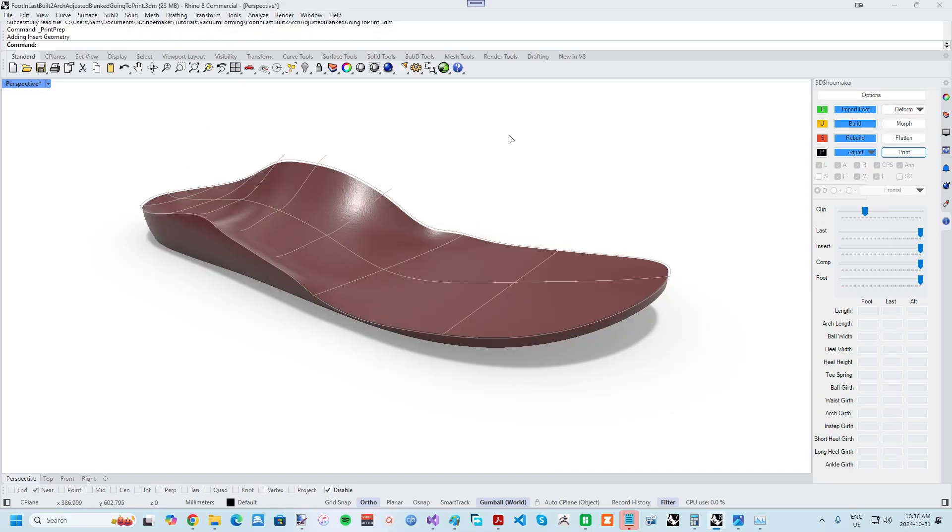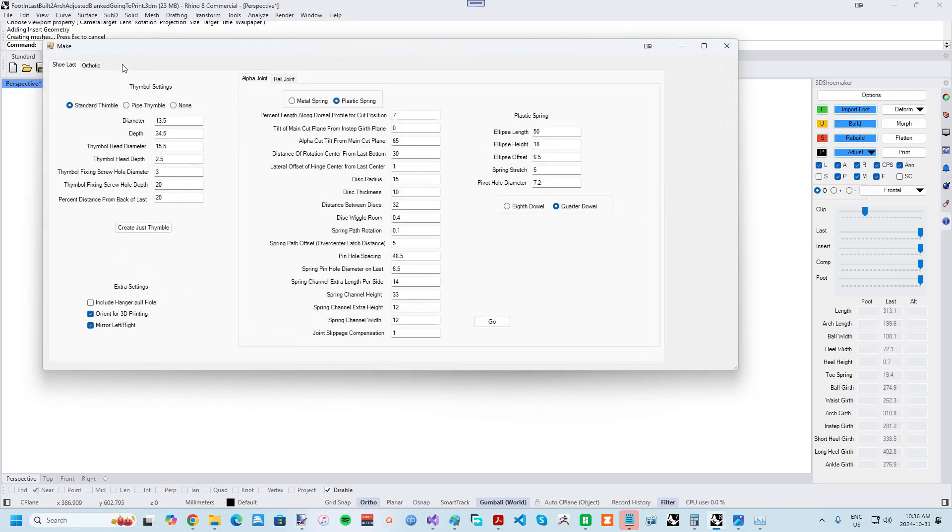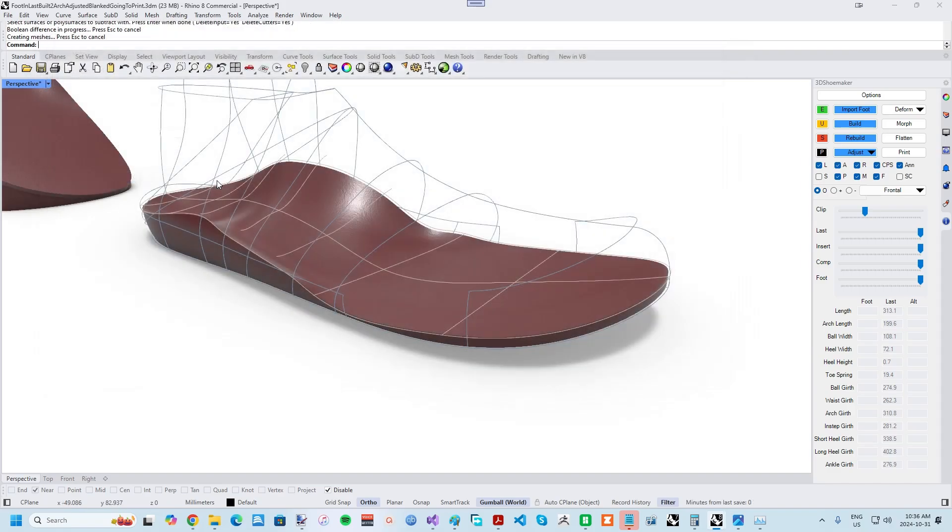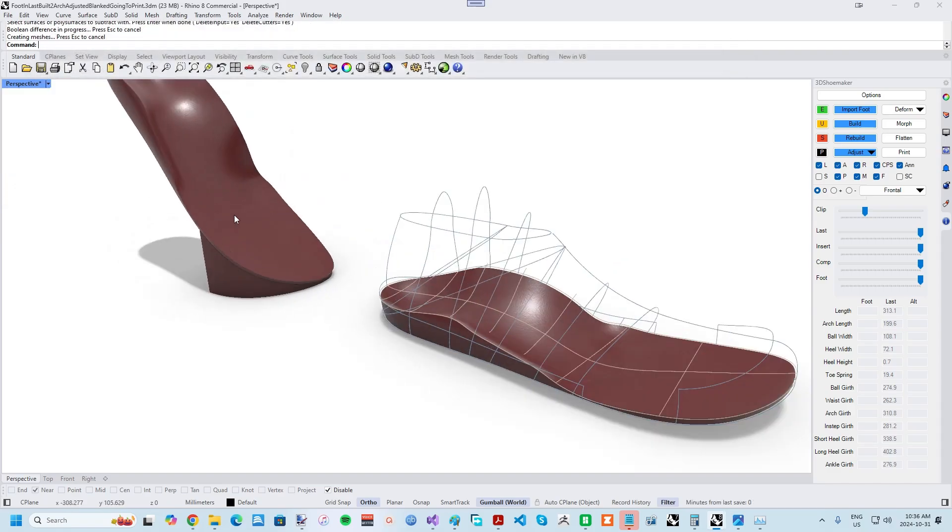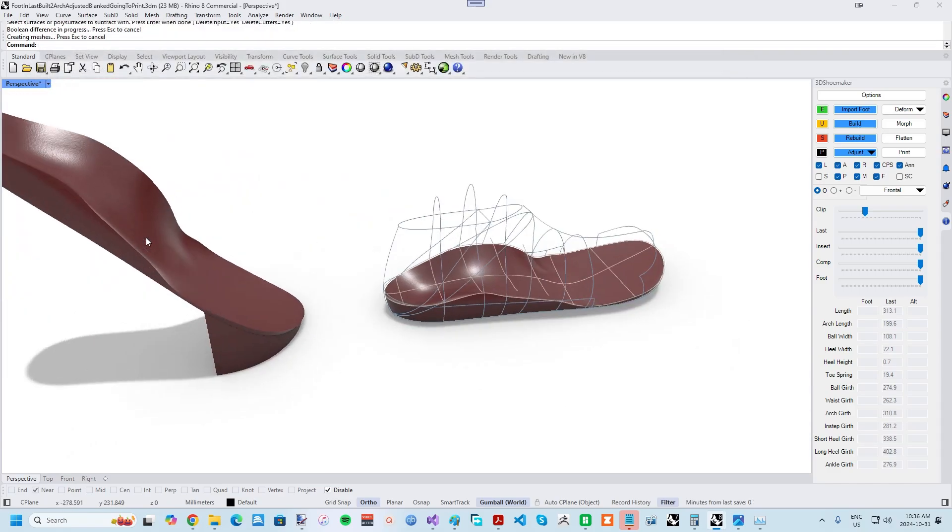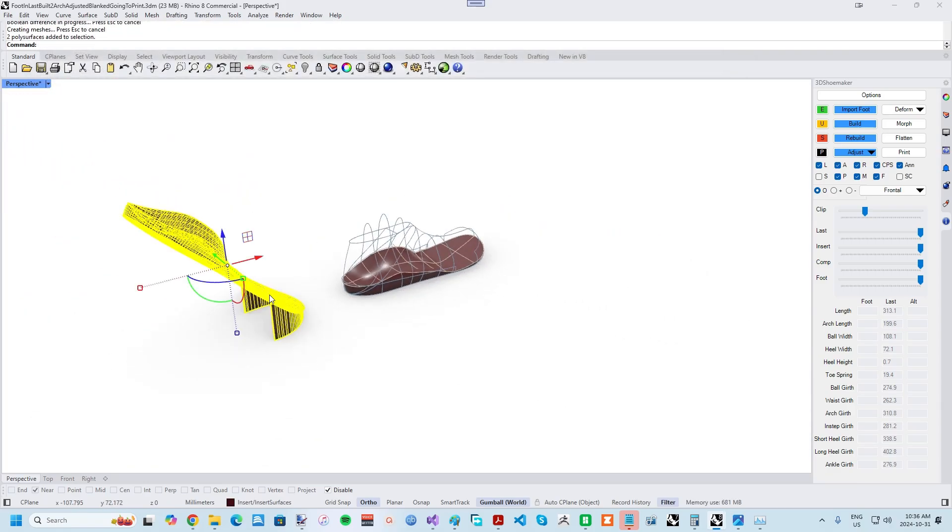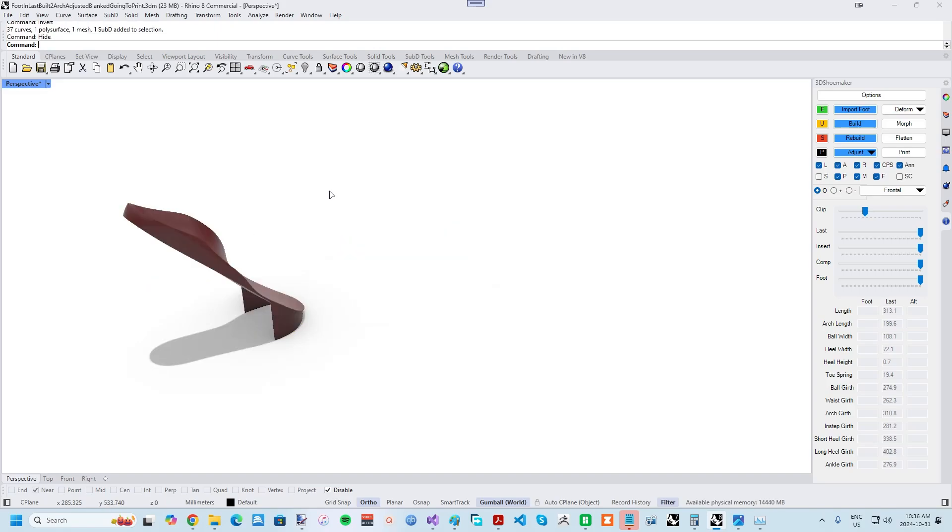If you are using an FDM printer to make orthotics, then you can press the Print button and go to the Orthotics tab and set up Smart Supports that help reduce support material and save on time removing supports. I'll get more into FDM printing and material selection in an upcoming tutorial.